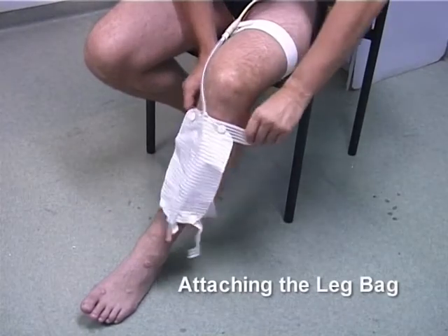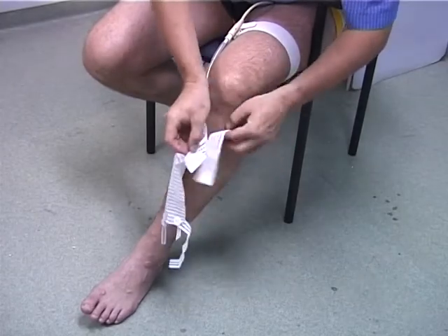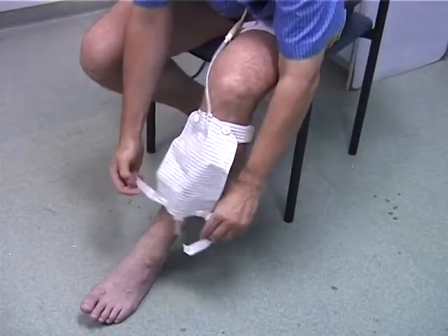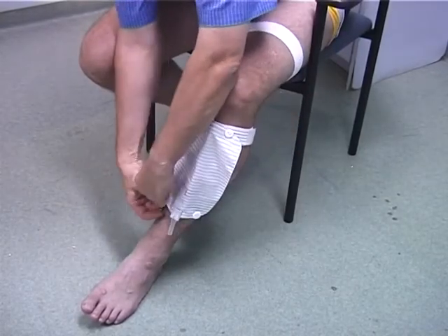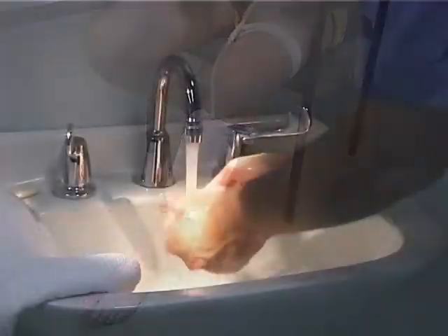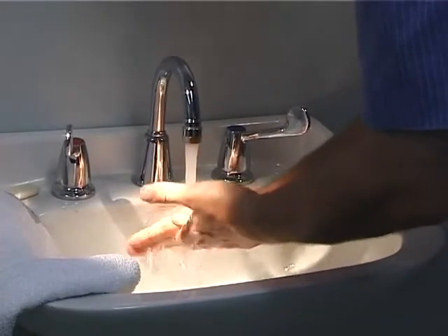Firstly, ensure that the catheter is secured to the thigh with a fixation device such as a cath strap. Then attach the leg bag to either the calf or the thigh using the Velcro straps provided. Tell the patient to thoroughly wash their hands before contact with the catheter or bags.